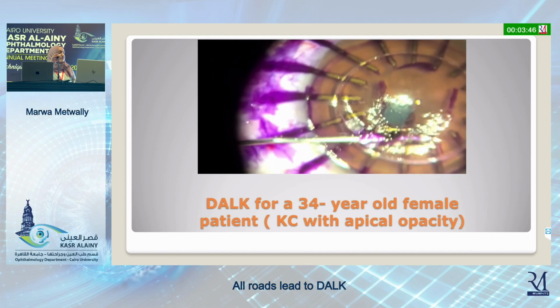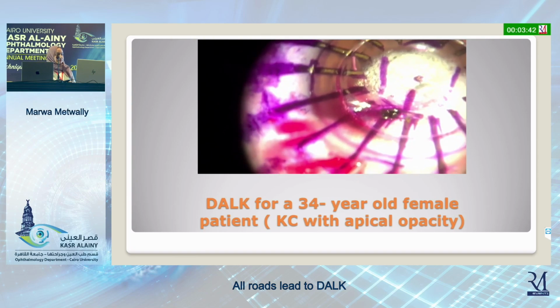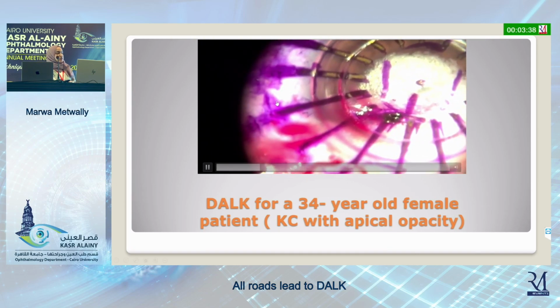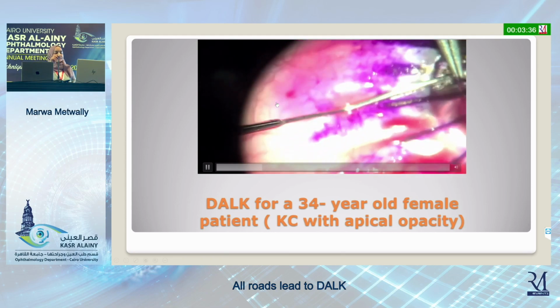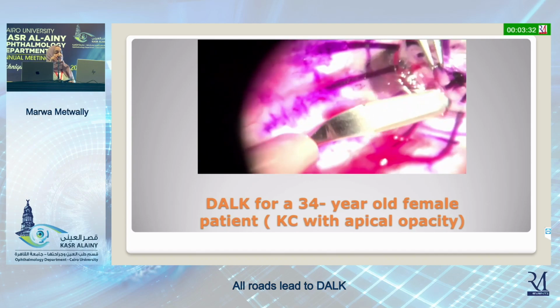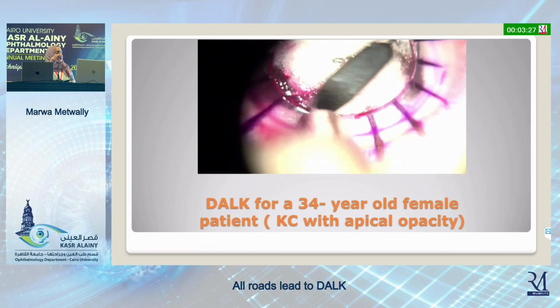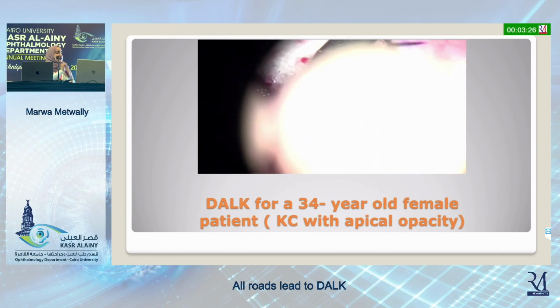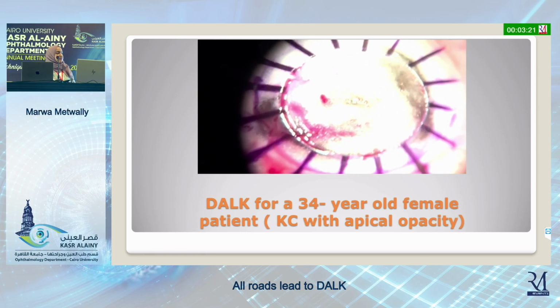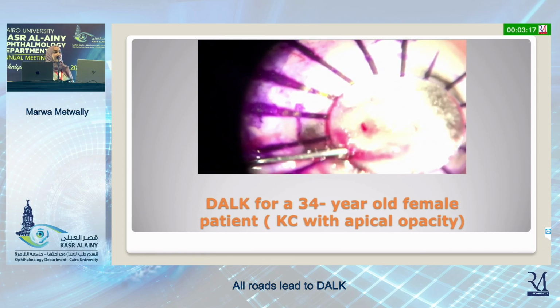However, there was just emphysema and the air passed into the AC. So I injected air in the AC again to guide me, and started again to do air bubble and just emphysema without bubble formation. So I did superficial keratectomy, and again I tried air injection at a deeper level, and we can notice that the big bubble is formed.